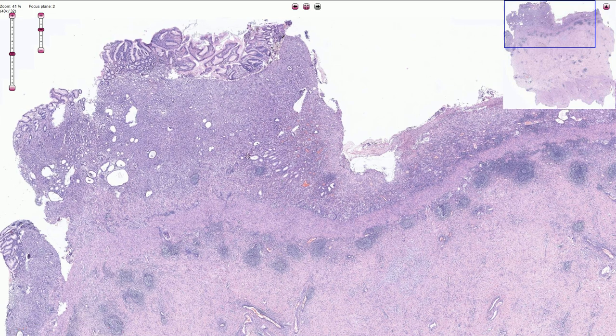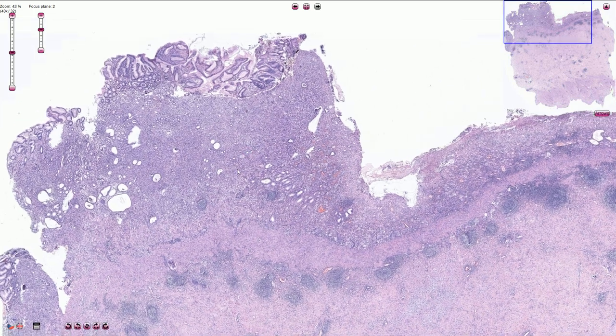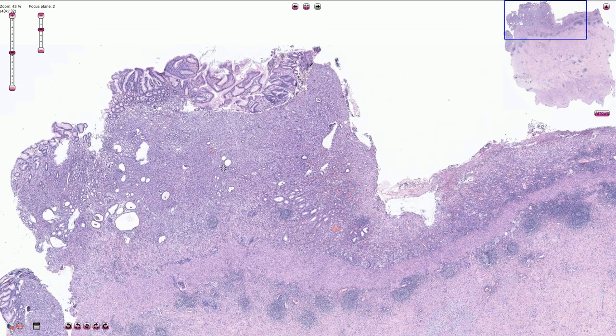The discohesive cells can have plasmacytoid, histiocytic, eosinophilic, or signet ring cell appearance.